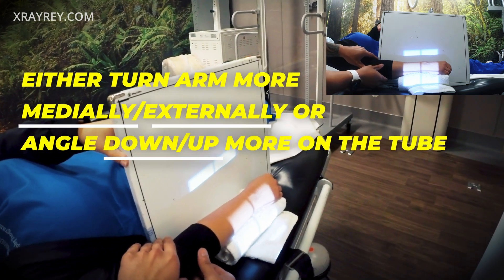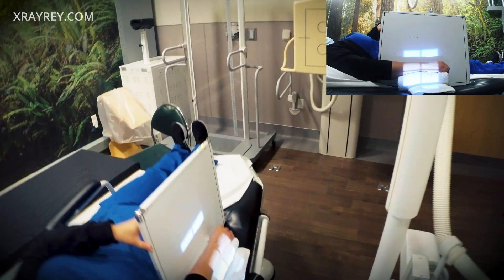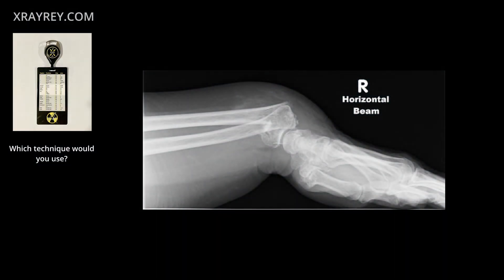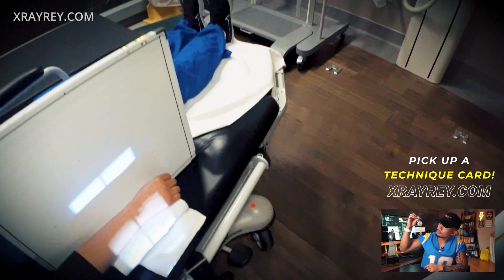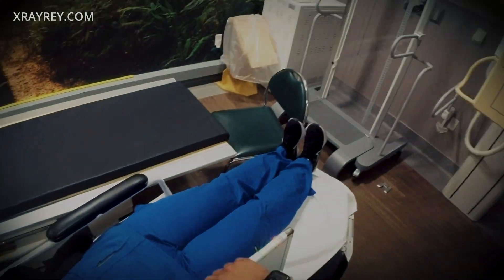Just turn your arm just a little bit more to your left if you can — kind of, there you go. Good, hold very still. Okay, we're all done. Take about 30 minutes for your results. Let me just move some stuff around here.